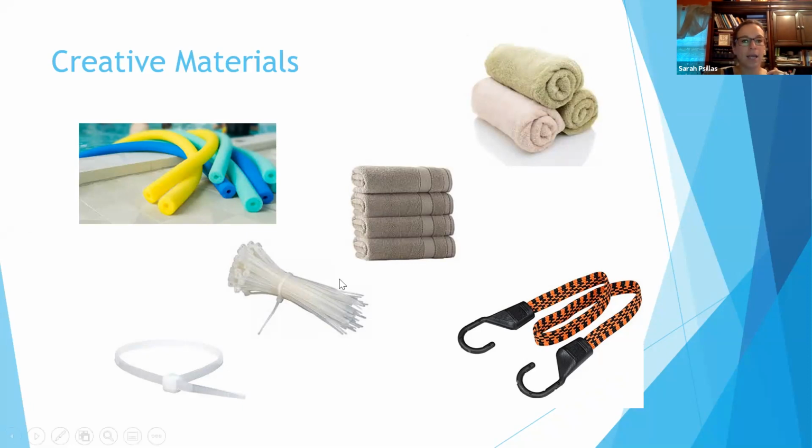A lot of times people attach them with a zip tie. And so zip ties are great. You put them on, you tighten them as much as possible, and then you snip this little pointy end off. And then I would suggest putting a little piece of tape or duct tape, or glue even, over it, only because the area where the zip tie is cut can sometimes be sharp.